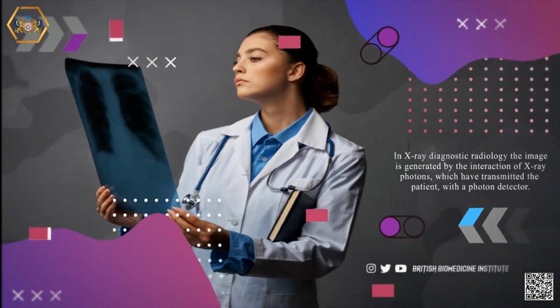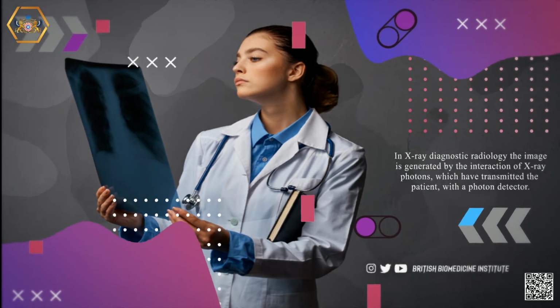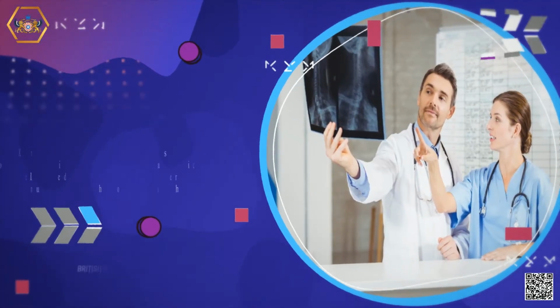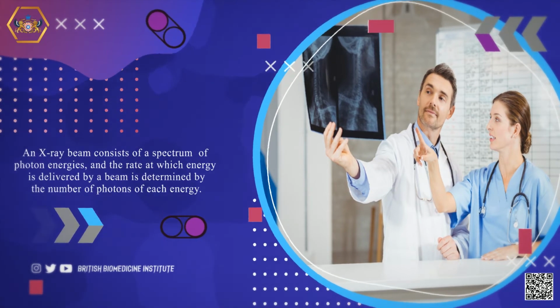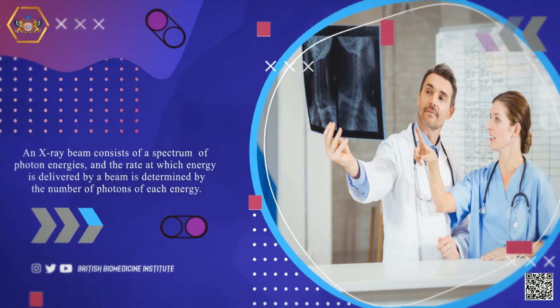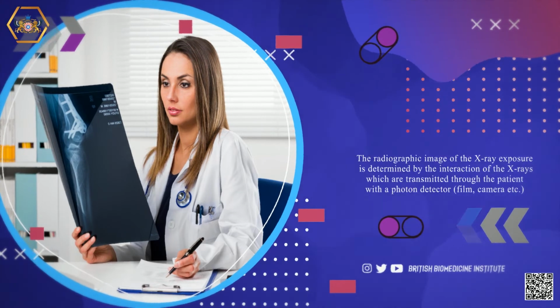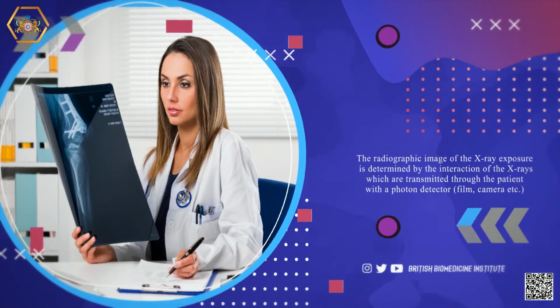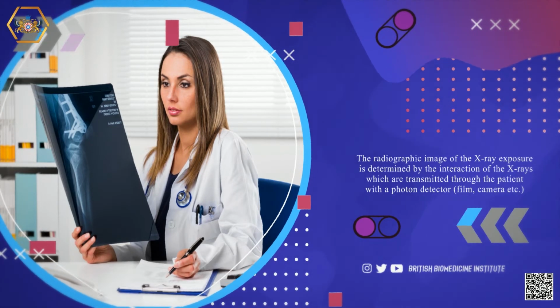In X-ray diagnostic radiology, the image is generated by the interaction of X-ray photons, which have transmitted the patient, with a photon detector. An X-ray beam consists of a spectrum of photon energies, and the rate at which energy is delivered by a beam is determined by the number of photons of each energy. The radiographic image of the X-ray exposure is determined by the interaction of the X-rays which are transmitted through the patient with a photon detector, film, camera, etc.